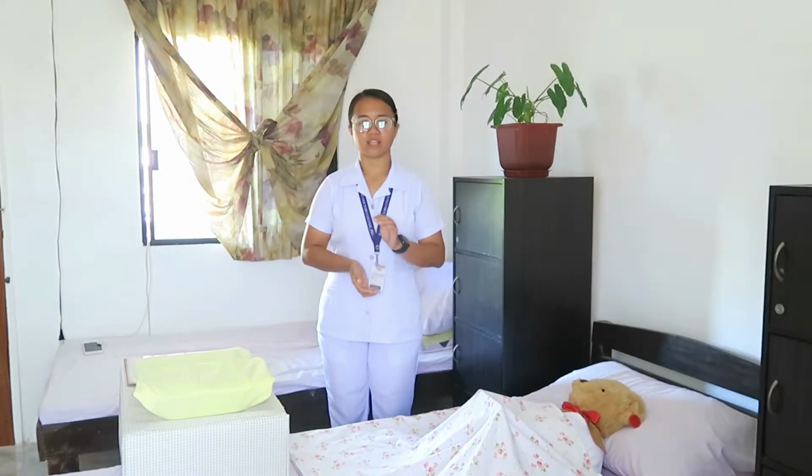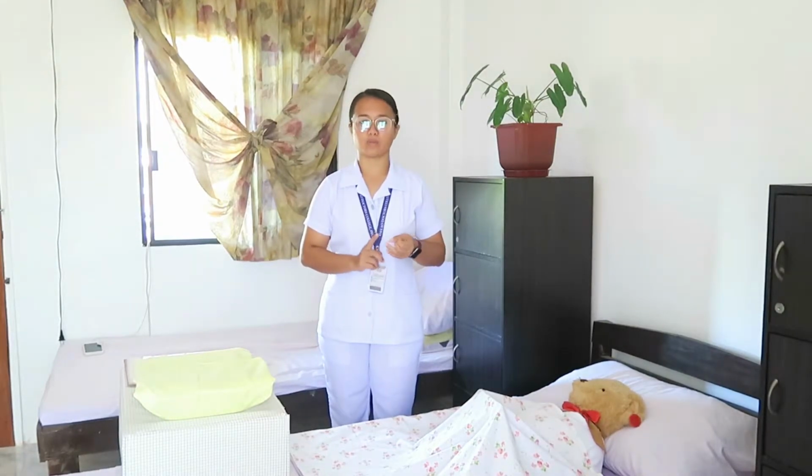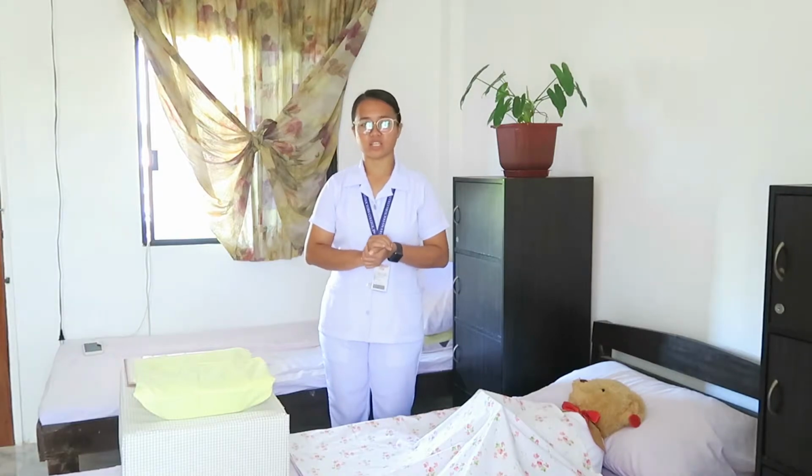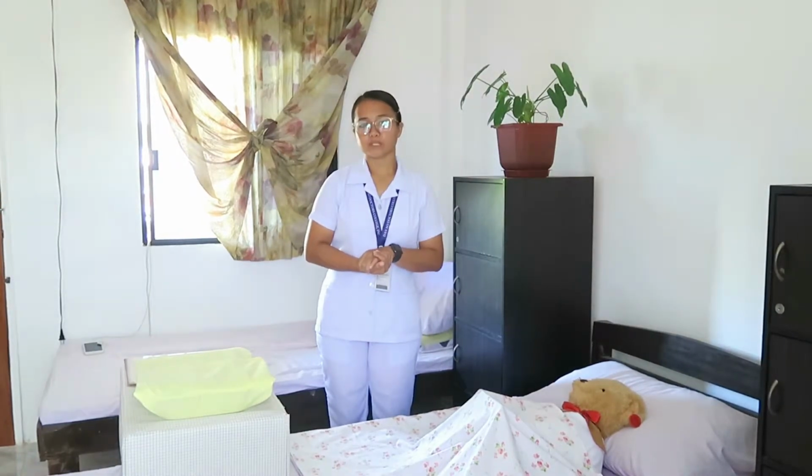So, the purpose of catheterization is to control urinary incontinence, to relieve urinary retention, to obtain a sterile urine specimen, to measure the residual urine remaining in the bladder after voiding, and to maintain an empty bladder during surgery, to provide access for instilling medication into the bladder, and to monitor early urine production in a seriously ill patient. So, now that I have discussed what is catheterization and the purpose of this, let's proceed to the materials.